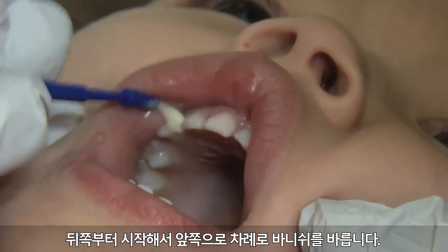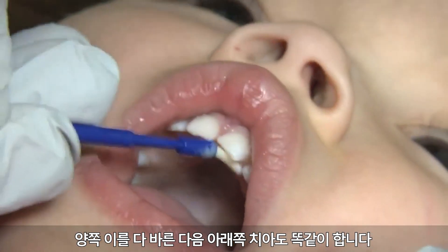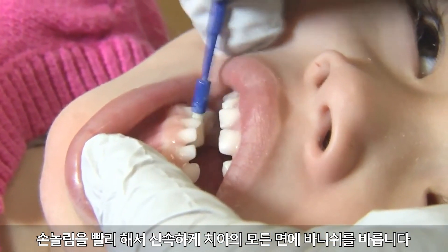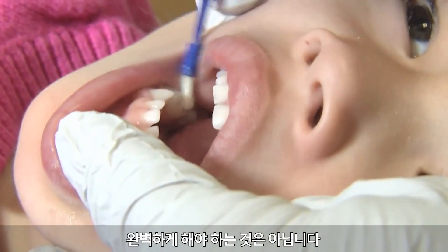Apply the varnish starting from the back and moving toward the front. Continue across the entire arch. Repeat the process for the bottom teeth. Apply varnish to all surfaces of all teeth using a swift painting motion. It does not have to be perfect.